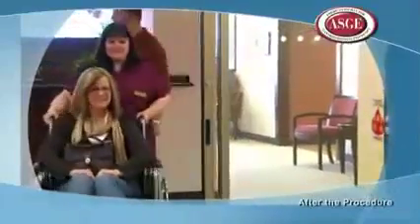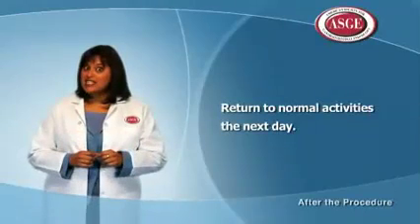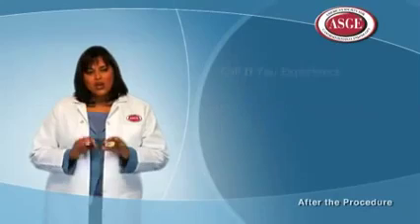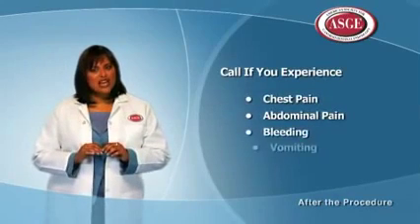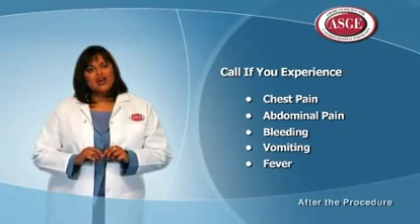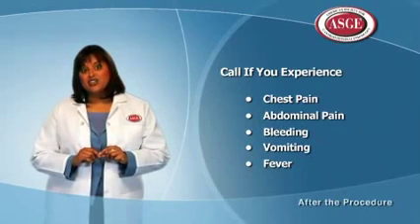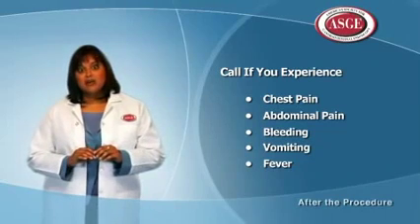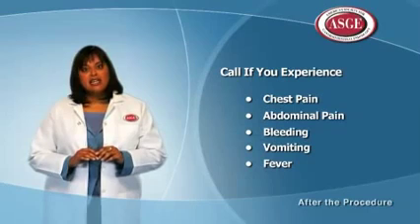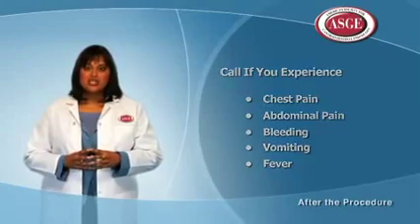Because of the effect of the sedatives, you will be asked not to drive or go back to work and not to participate in any physical activities. You can return to normal activities the next day. Occasionally, patients have a sore throat after the exam, which usually goes away within a few hours. Although complications are rare, you will be given a number to contact your doctor if you have any chest or abdominal pain, bleeding, vomiting, fever, or if you have any other questions or problems related to the procedure.